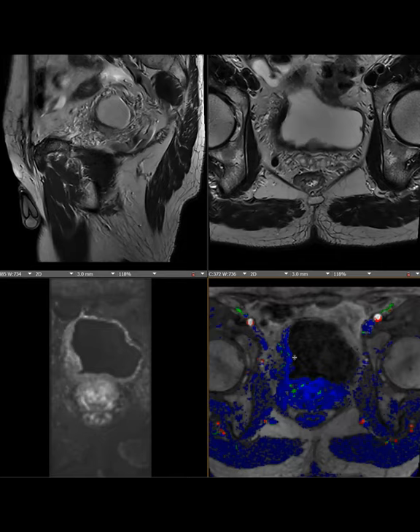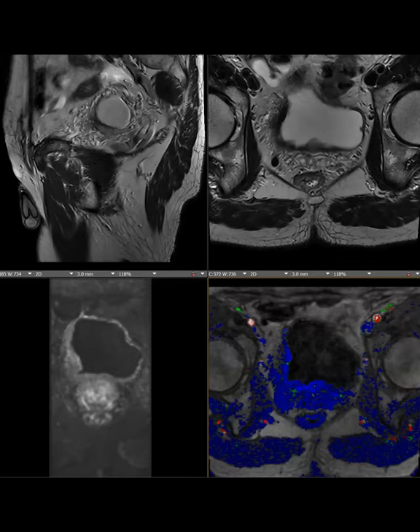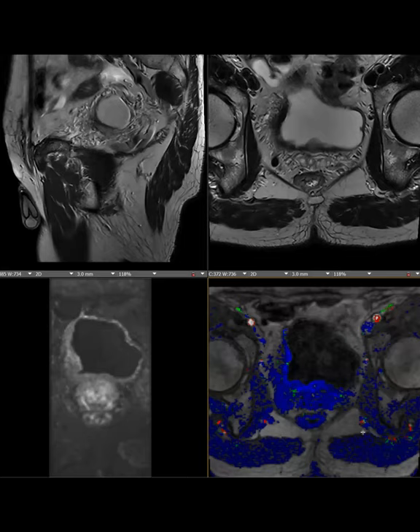There's abnormal enhancement. But like Steve is saying, that's not super avid enhancement, right? If it was avid, it would be more red. I think you're right. We don't use color, so I don't know. On these color maps, what color would your prostate cancer be? It should be red, like you said, because of wash in, wash out. So this makes sense that the urothelial, which has low level enhancement, doesn't have that red enhancement, but it has some thickened enhancement, I guess. Compared to the normal left side. I would have read this as enhancement relative to the left.